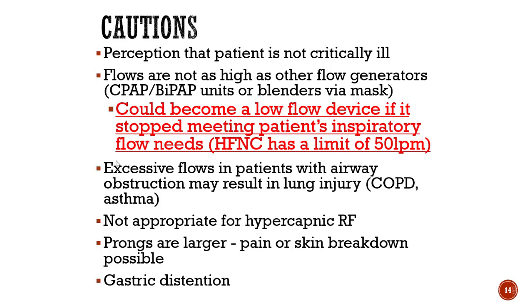Another thing that can happen is gastric distension. Anytime you have high flows going into your nose and mouth, some of that gets down into your esophagus, because of where your trachea and esophagus are positioned, or when a patient is eating or talking with high flow on, some of that air is going to get into their belly. And so it can create some discomfort there. Again, going back to your neonatal population, they can get a lot of air in their bellies.